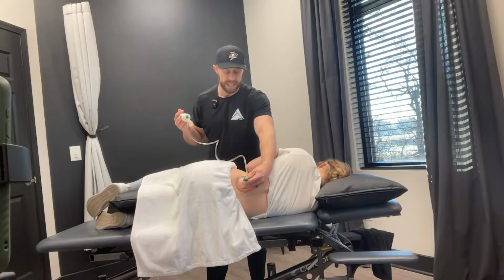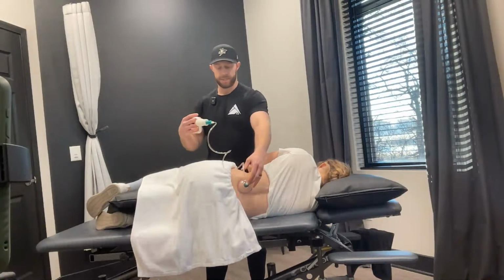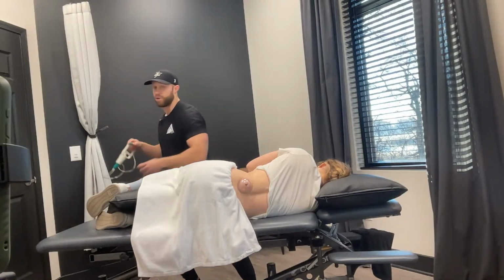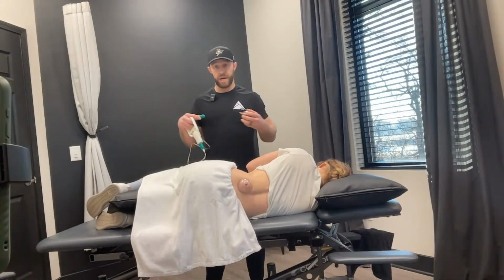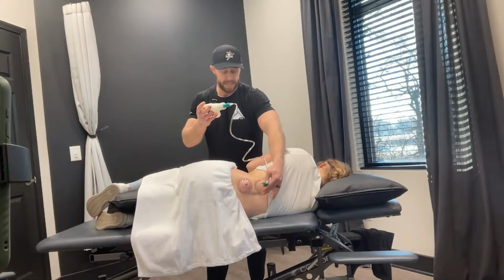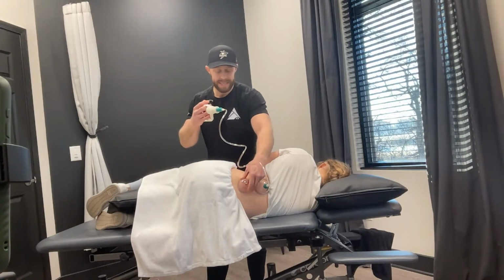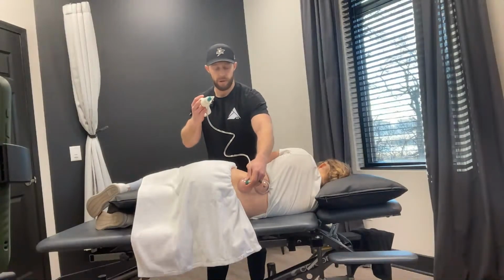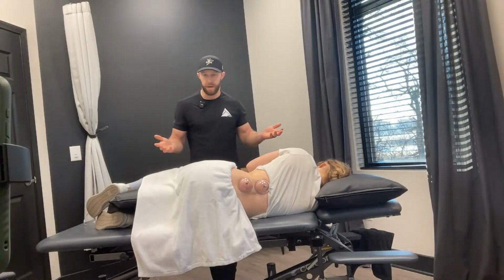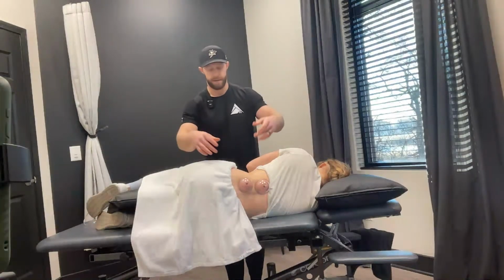And then you're just going to get these things on with a little bit of tension. So a couple of pumps to start is plenty. So I don't have this thing cinched all the way down where she's in a ton of a stretch feel. Instead, I just have a little bit of air out of the cup and a little bit of domed tissue within that cup. This gives you that nice decompressive feel if you're the client. A lot of times they'll be a bit uncomfortable when you first do this, but they're uncomfortable anyway. They've been in spasm for a few days, and so it's no major deal to them.